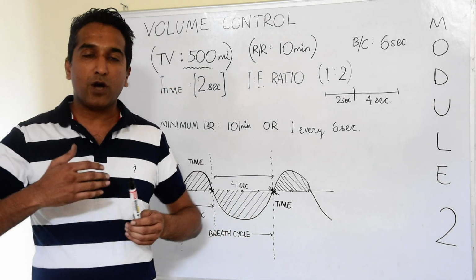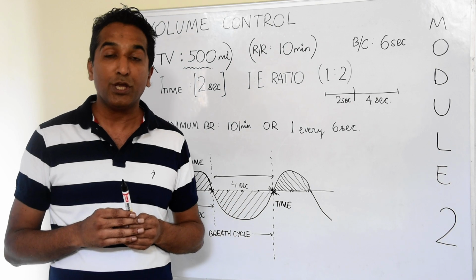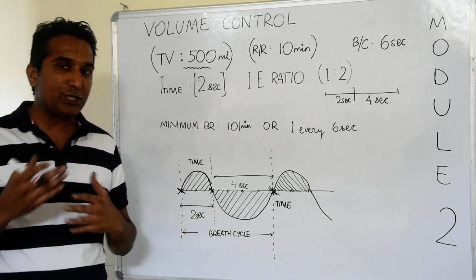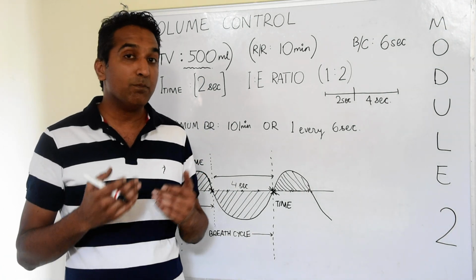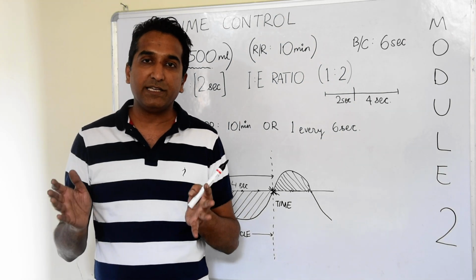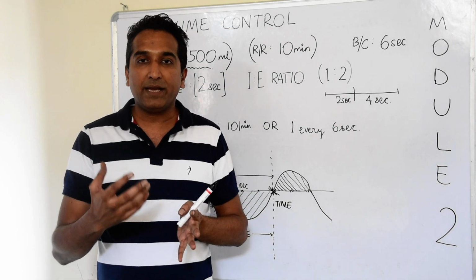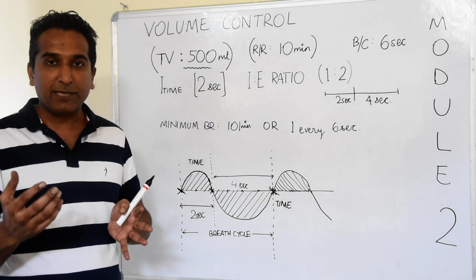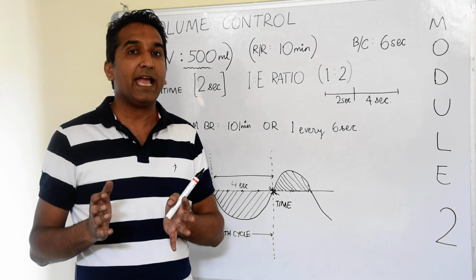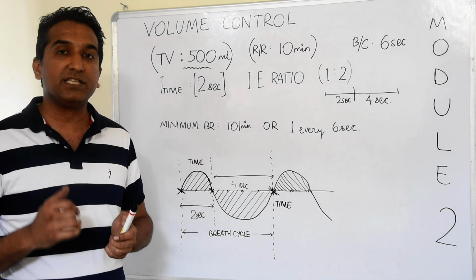And I said, for all practical purposes, all new ventilators work in the assist control mode, which means that the ventilator will deliver 10 breaths, but if the patient makes an effort to breathe more than this rate, then the ventilator will allow it. Now this wants the ventilator to recognize when the patient is making an effort to breathe. When does the cycling take place? Can it be decided by the ventilator? In some modes yes, in some modes no. And how is the breath cycle defined when the patients are on an assist control mode?